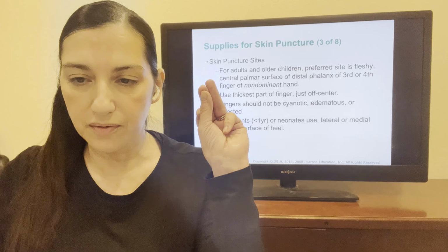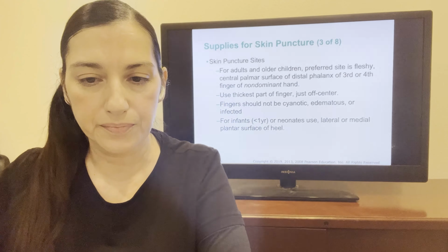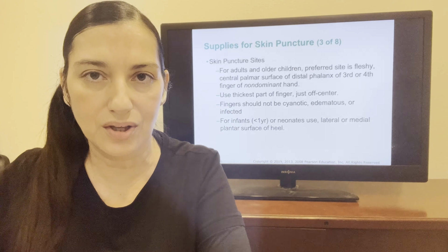Use the thickest part of the finger just off the center. Fingers should not be cyanotic, edematous, or infected. For infants less than 1 year old or neonates, use the lateral or medial plantar surface of the heel.